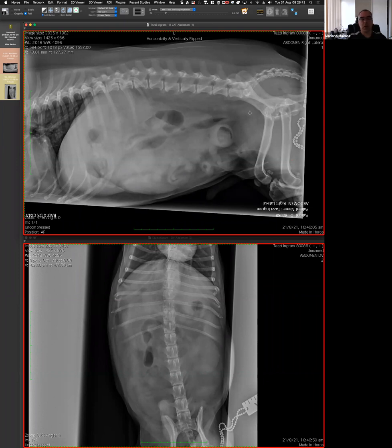When they bring a vomiting dog and want me to do an ultrasound, my reaction is, do you have radiographs? Because I know that I'm going to scan the whole thing and be systematic, but having a radiograph is going to direct my search. Makes sense? So I'm going to say, well, looking at the radiographs, I can rule this out, or it's very unlikely, and I think this is the problem. So I'm going to put the probe there and try to solve the problem, and then complete the ultrasound to make sure that I'm not missing anything. That's perfectly fine.